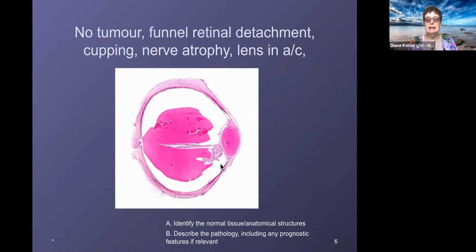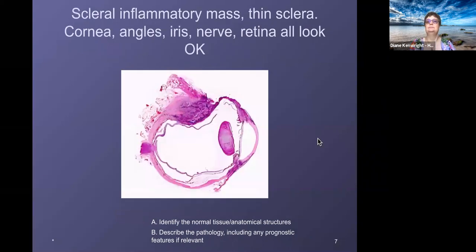looking any deeper in. Another trick is to use the terms that you're used to using when you use the slit lamp. Okay, so you are used to describing things microscopically, just with a biomicroscope. So if you're describing things in the anterior chamber, feel free to use the terms that you would usually use when you are looking down the slit lamp. Let's look at another example.